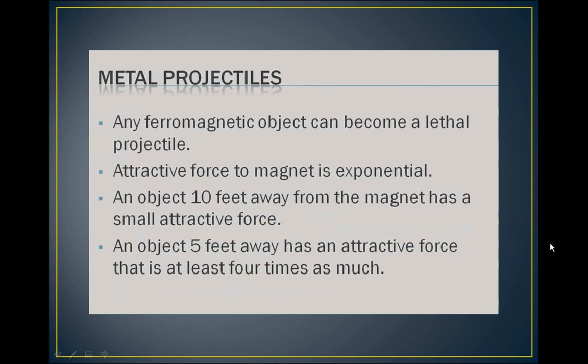We need to make sure that the MRI suite is a restricted area for all patients, and personnel are properly screened and cleared of any ferrous material. Signs must be clearly posted to warn the staff and patients of potential dangers of the magnetic field. Door locks and/or key code boxes should be in place on the MRI suite doors to ensure that no unauthorized staff or patients enter the MRI suite.